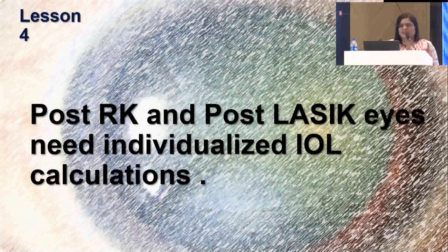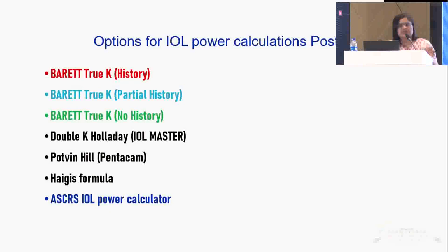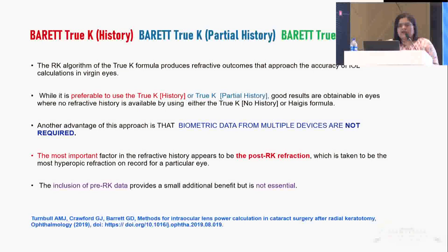Lesson number 4, post-RK and post-LASIK eyes need individualized IOL calculations. You have multiple formulas: Barrett True K with history, with partial history, with no history, with double K Holladay, Potvin-Hill, Haigis formula, and the online calculators, the ASCRS power calculators. All these formulas have been proven, for example, in this particular study, which said that it is preferable to use the True K history or the True K partial history formula. But good results are obtained in eyes where no refractive history is available by either using the True K no history or Haigis formula as well.